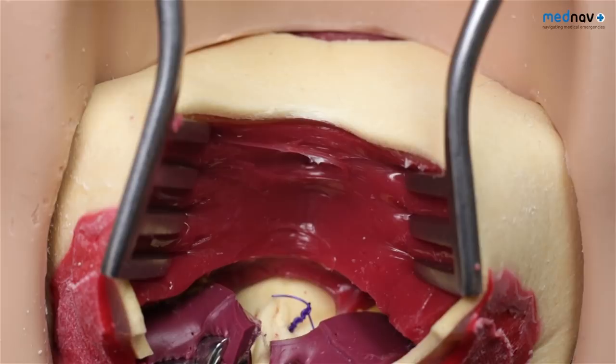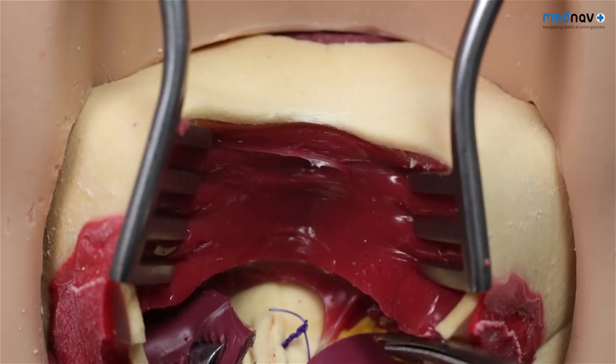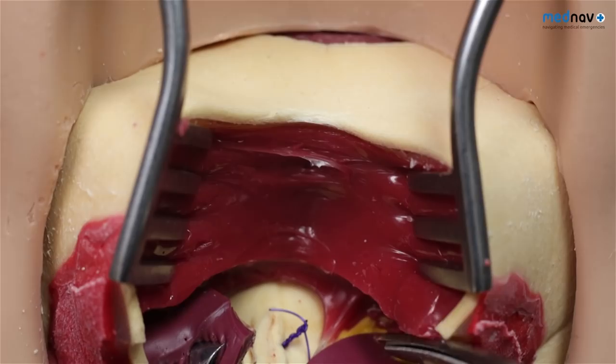The overlapping technique may require dissection of the external anal sphincter to the pararectal fat, which is seen as a yellow adipose tissue. This allows for adequate mobilisation of the sphincter.